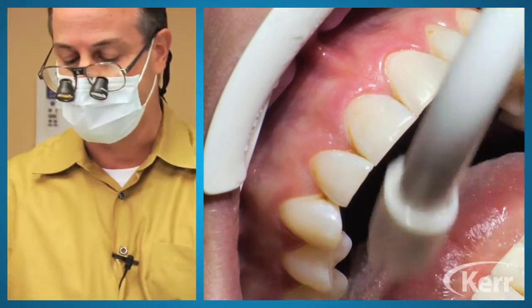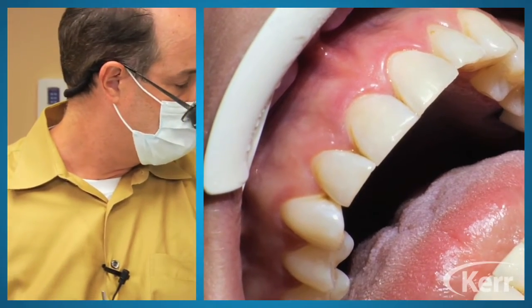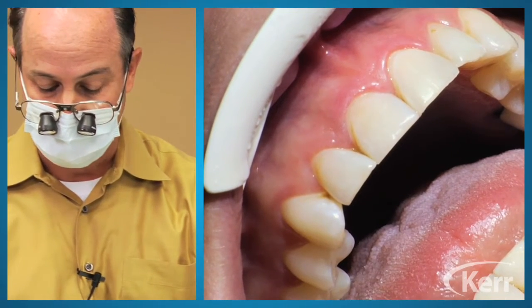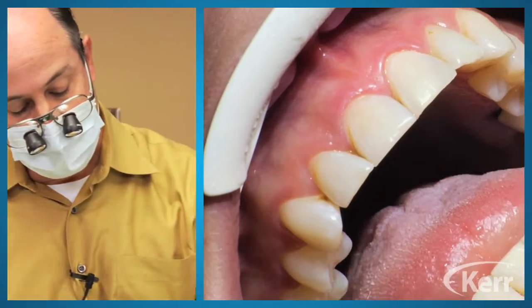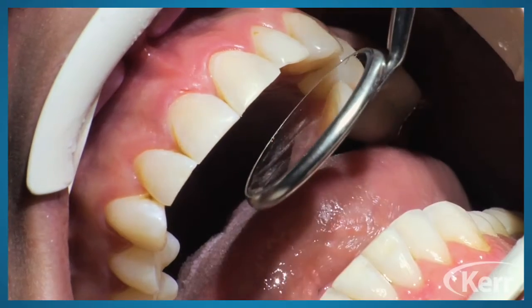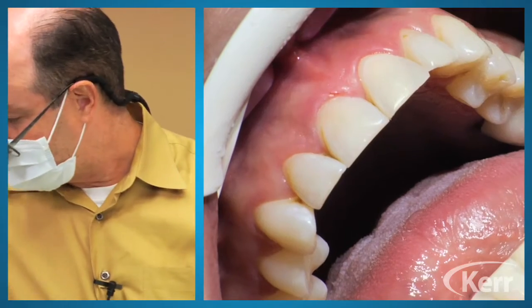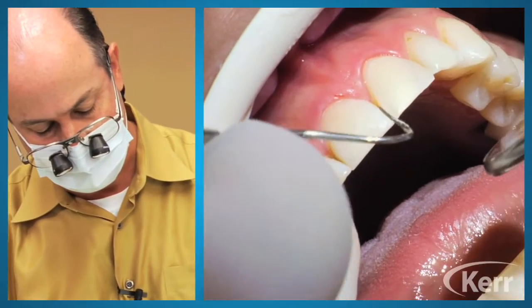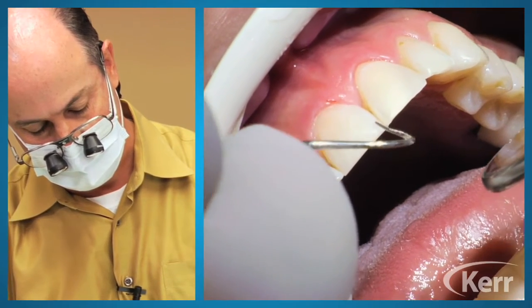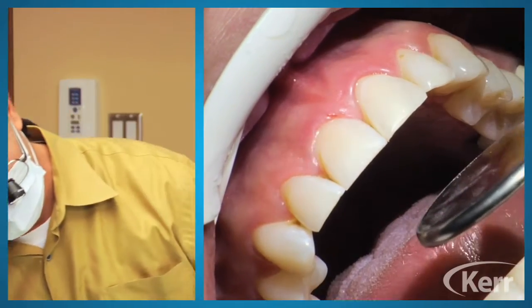Let me give you just a fine. So all I've done on the facial surface here is taken a medium disc to the facial surface, and now just a fine disc pretty much mirrors the luster of the adjacent tooth, that's what we're trying to do in dentistry. And that's quite a nice shine there. And we can see that at this point, pretty nice, seamless, really restoration here for the patient.